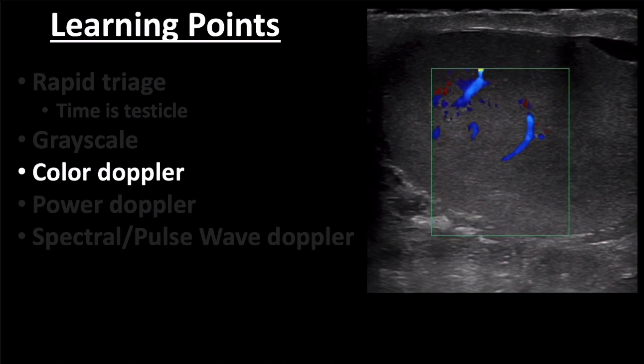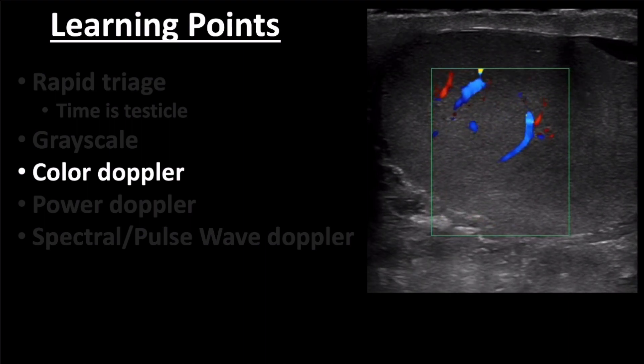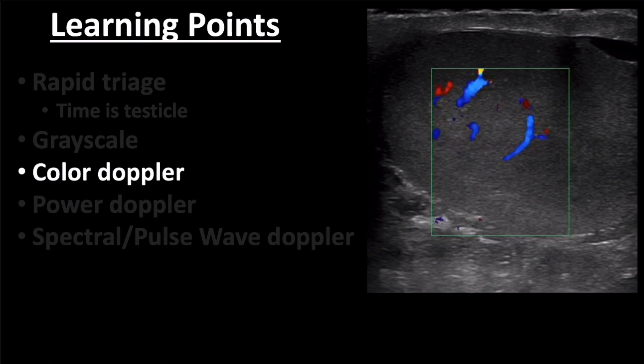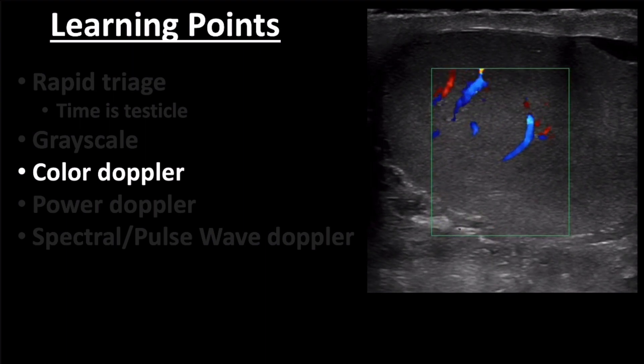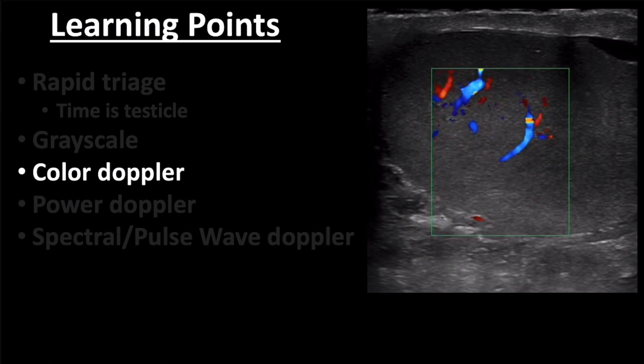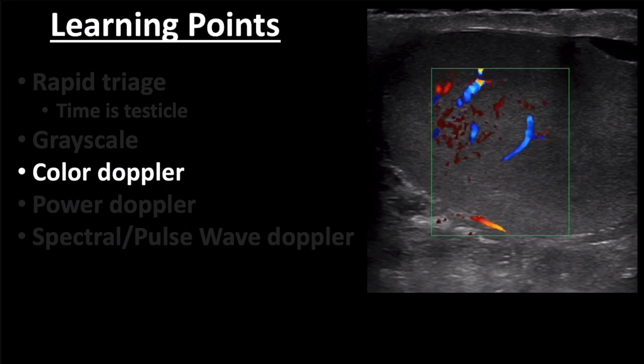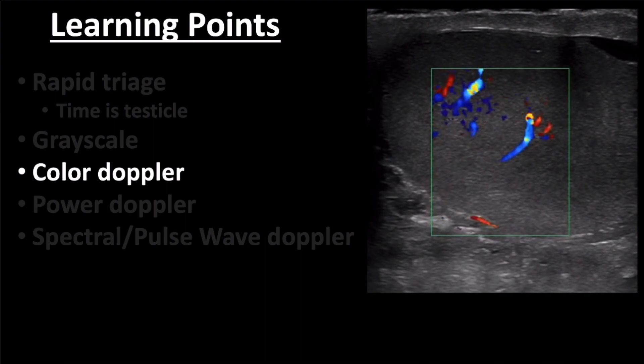The performance of color Doppler is operator dependent and I recommend scanning the unaffected testicle first in order to optimize scale and gain to visualize the most blood flow without artifact. This simple step should give you more confidence either the presence or absence of flow in the affected testicle.